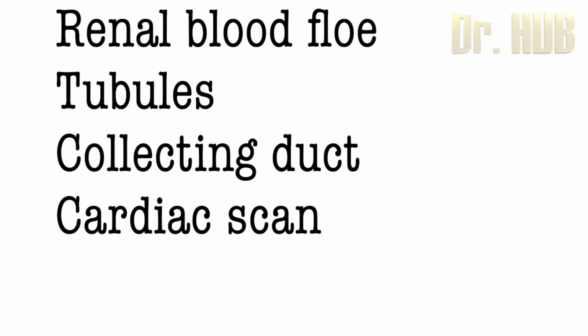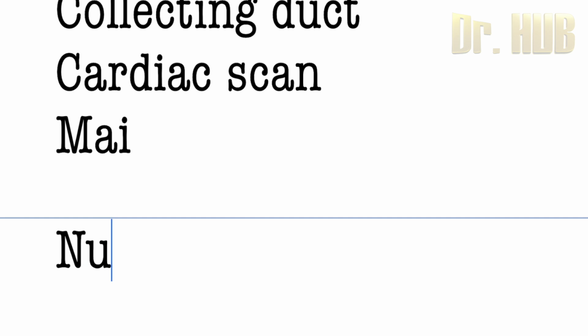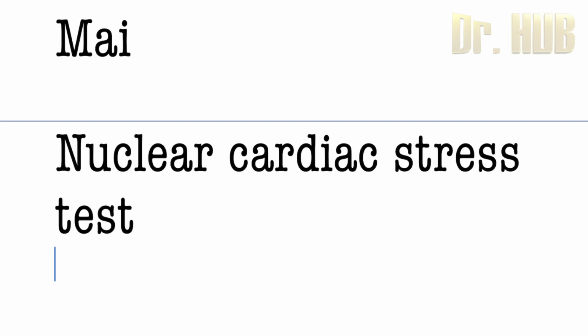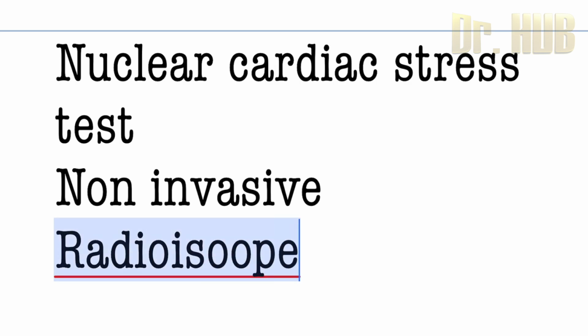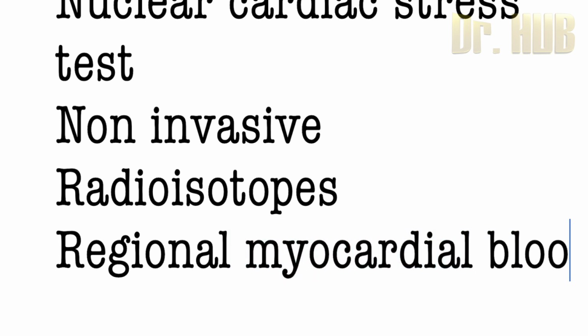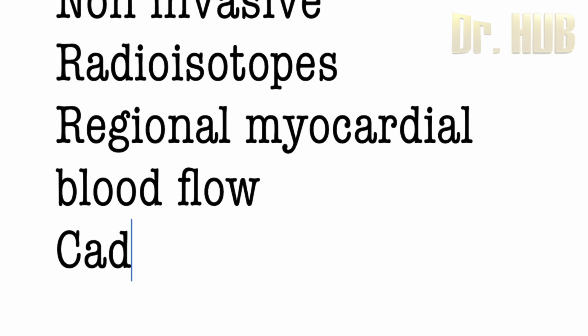Now let's move on to the cardiac scan. Here in the cardiac scan, it is the myocardial perfusion imaging, that is the MPI or the nuclear cardiac stress test. It is a totally non-invasive method that uses radioisotopes to assess the regional myocardial blood flow, then the function and the viability and the diagnosis of CAD.